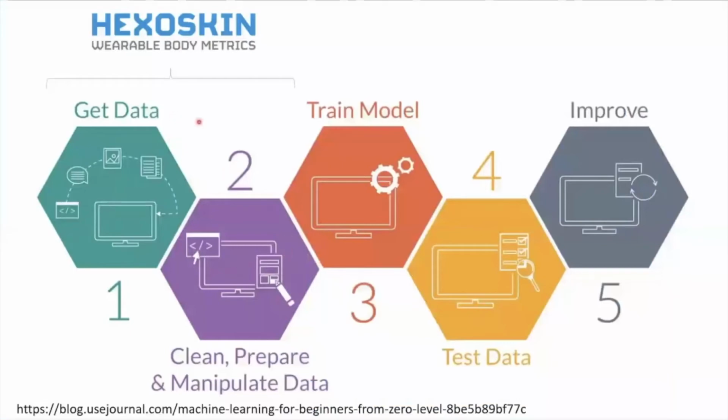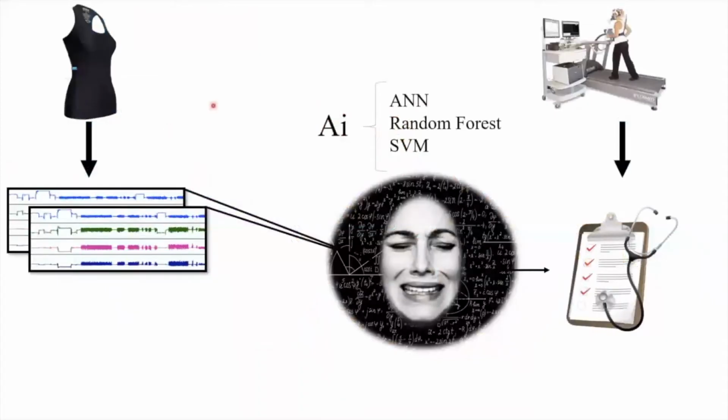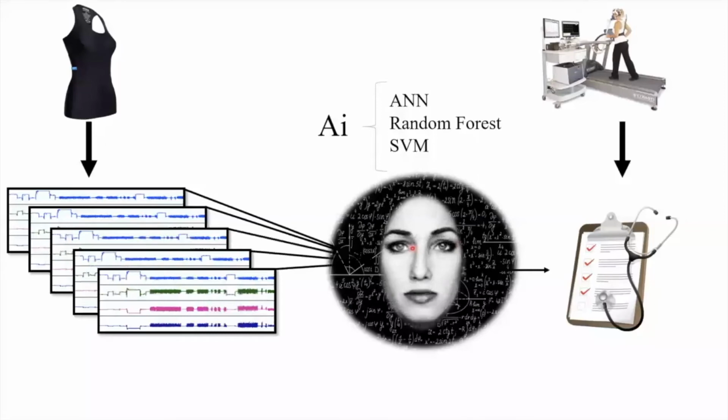And as I said before, Hexoskin is doing a really great job in terms of collecting a good spectrum of long-term biological data, as well as cleaning and extracting physiological variables from the raw signal. And what we are doing here is extracting information that matters to train some algorithms to predict available indexes based on these physiological variables. So what we actually do here is train an initial, let's say a naive algorithm, by offering it some real life examples. And by experiencing the relationship between a given input and the output, the algorithm evolves and learns how to predict the output only based on the input.